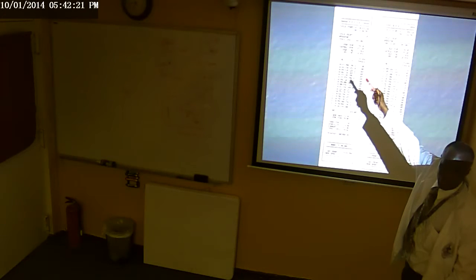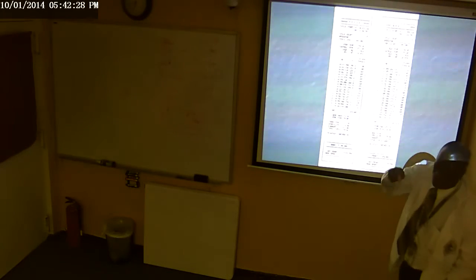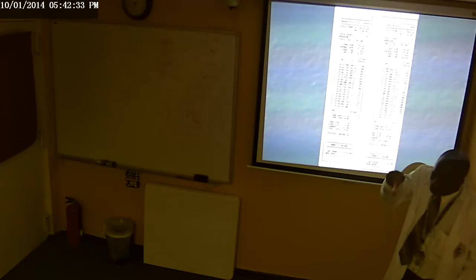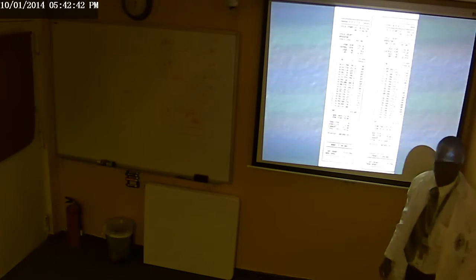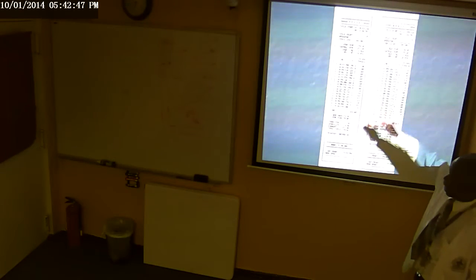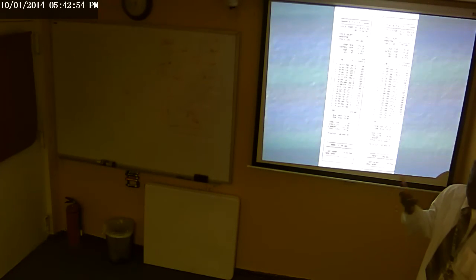Gravity is natural. Natural what? Air is, put it simple. What did you say? Air is removed naturally. Oh, but use the right terminology. Air is moved by what? By nature. Put it right, I want the right terminology. Air is moved by what? Gravity. Air is moved by gravity. And then the prevac, air is moved by what? A man-made mechanism. It could be a vacuum pump or air removal system. So here it's telling you it's prevac. Cycle started at this time on this.